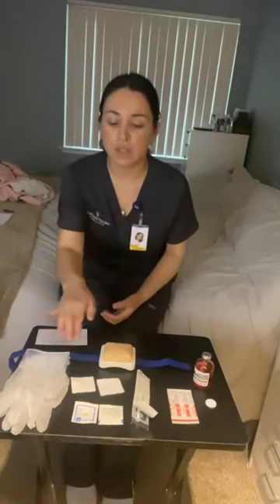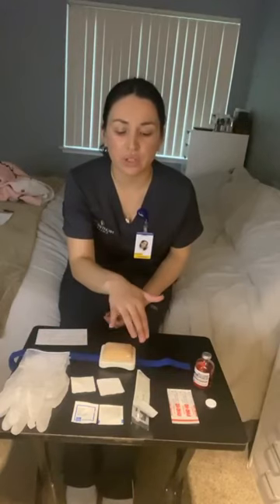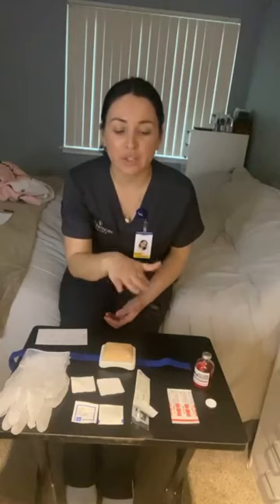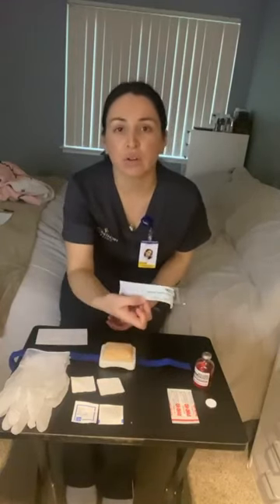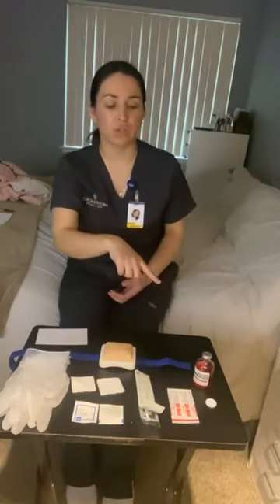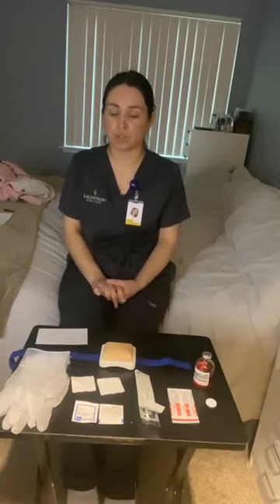I have gloves, gauze, alcohol swabs, a 29 or 30 gauge half-inch needle, and a 1 milliliter syringe. In this case, we have the needle already permanently attached to the syringe, a band-aid if needed, and the medication vial. Next, I'm going to verify my 6 rights of medication administration, which include right patient, right route, right time, right drug, right dose, and right documentation.